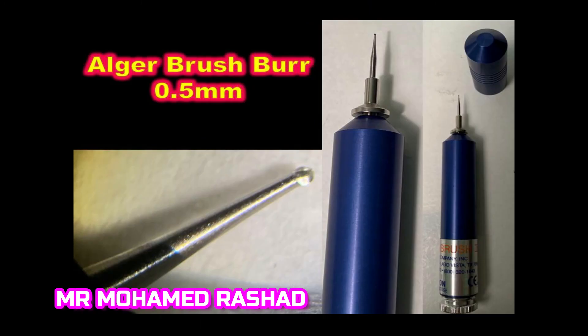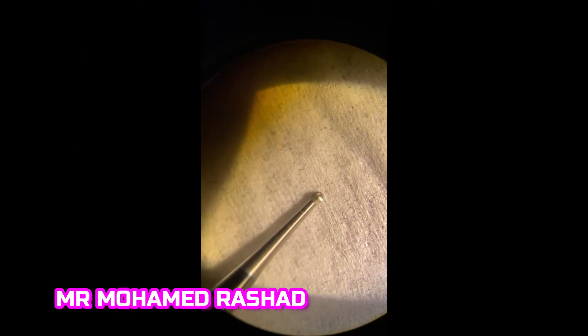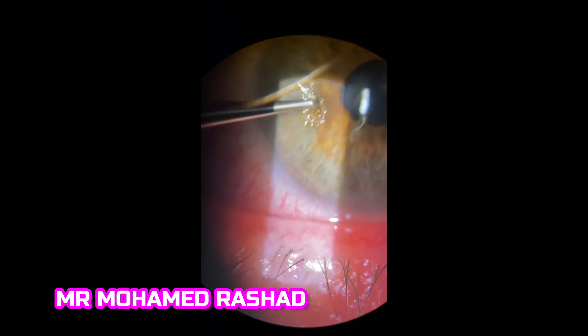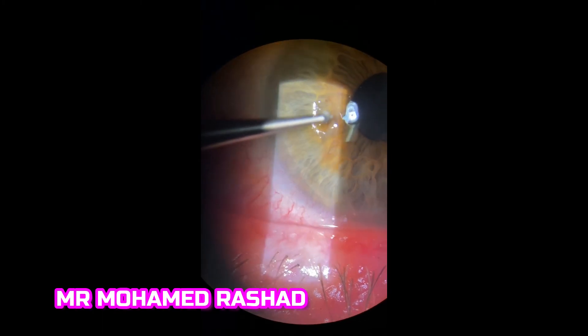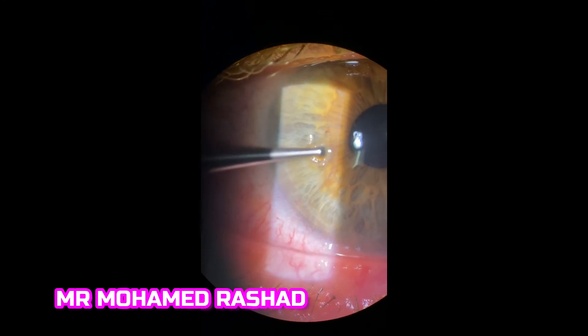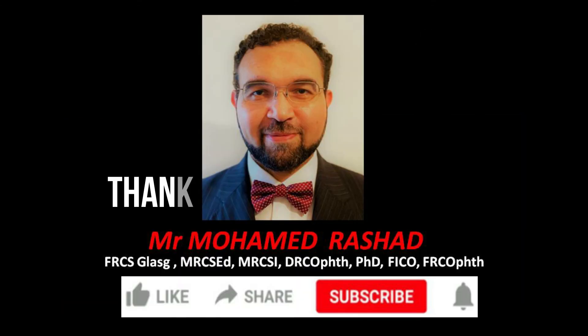With the Alger brush burr, you can remove the remaining rust ring. Make sure you are not going very deep. This is the appearance after removal, and this is after approximately one month with some scarring.